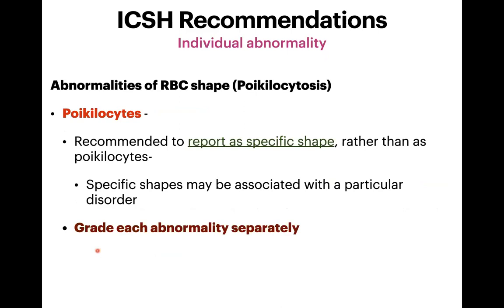Then poikilocytes, don't describe them just as poikilocytosis. It is recommended by ICSH that you describe them as a specific shape rather than just poikilocyte, because like we have talked about in detail, these specific shapes may indicate a particular diagnosis. So you describe them as a specific shape and grade each abnormality separately. Every type of poikilocyte should be graded separately.